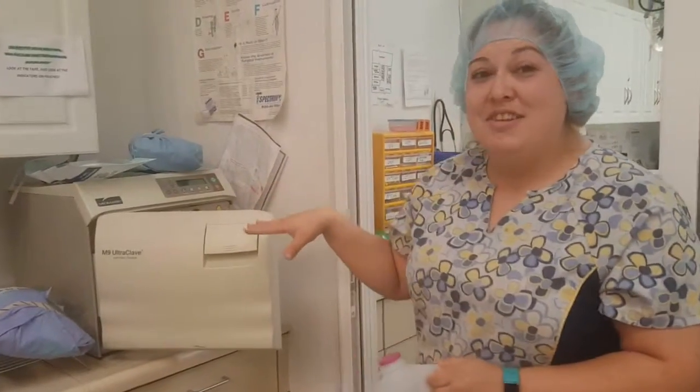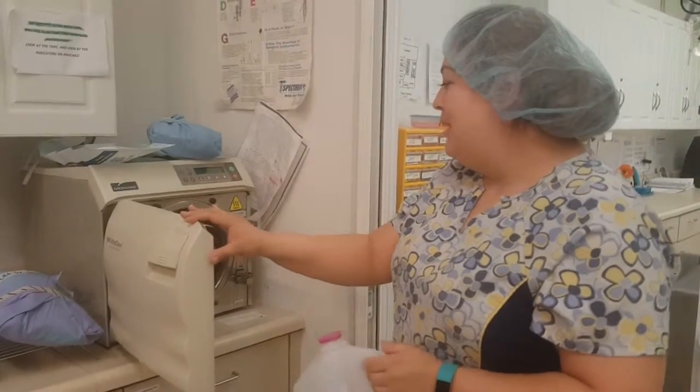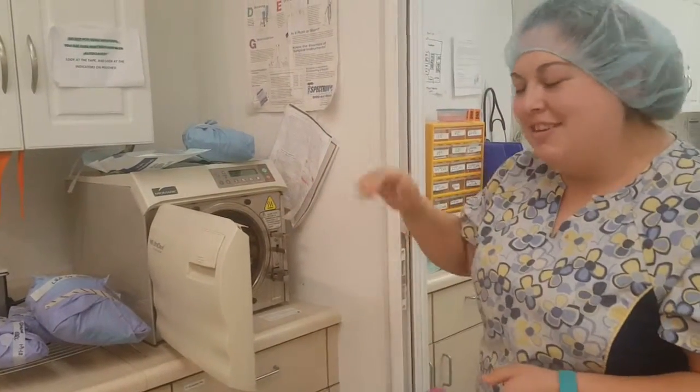I'm going to show you how to use an autoclave today. We have one of the nice automatic ones — just push some buttons and you're good to go.